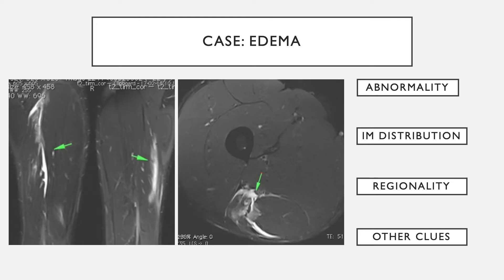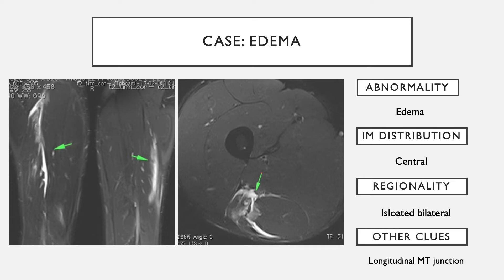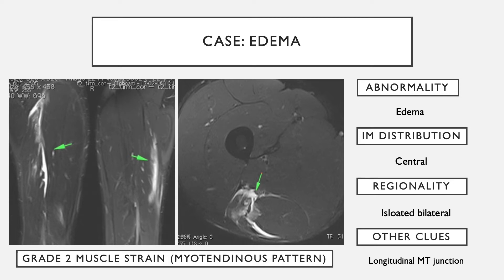In this case, there is fairly discrete linear edema bilaterally. On cross-sectional imaging, it is more central, centered around the myotendinous junction. It is isolated and longitudinally along the myotendinous junction. This is a typical example of a grade two muscle strain — the myotendinous pattern — where the injury is along the myotendinous junction.